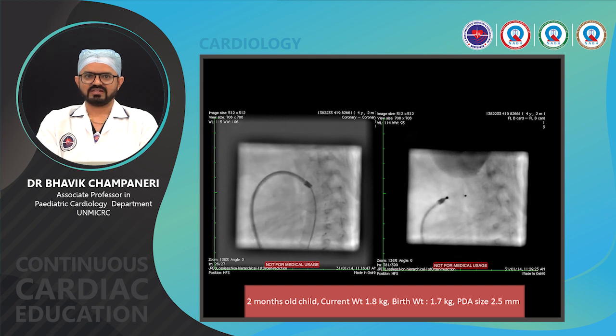This is an angio through the venous sheath parked across the ductus arteriosus, and the angio shows a ductus arteriosus which is more of a tubular ductus, which is a common anatomy in preterm babies. The same ductus arteriosus is being occluded with a device specifically designed for preterm babies, the Piccolo device, initially known as the ADO2 additional size device, and the procedure was successful.